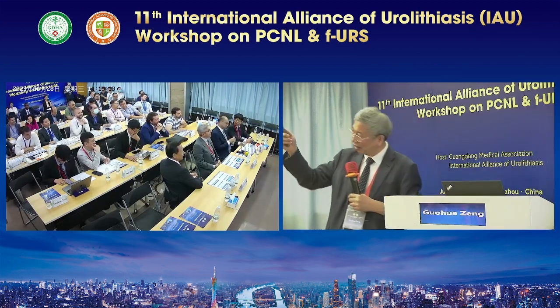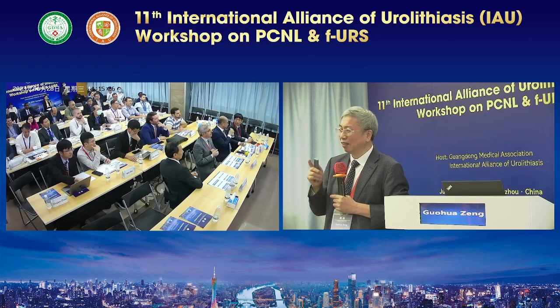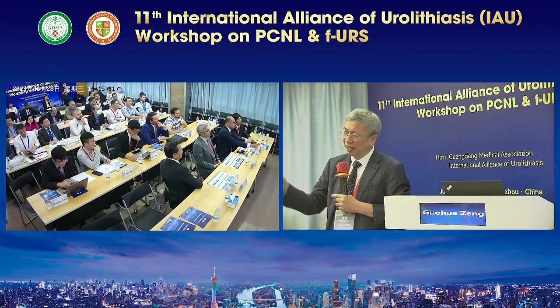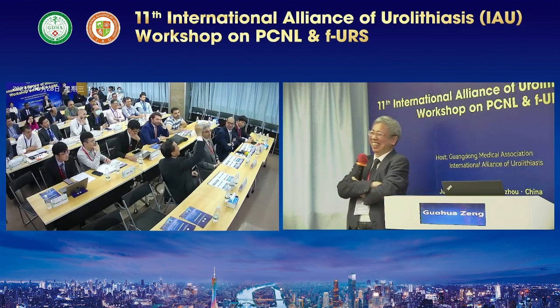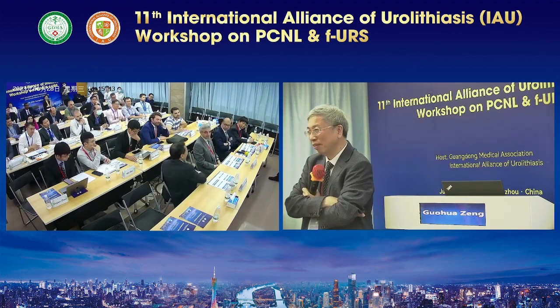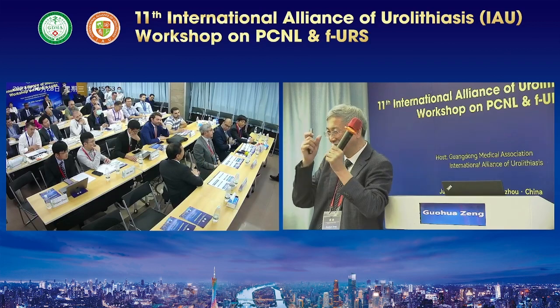Actually, come back to the real world. Actually, one is enough. Some very complex case, very difficult case, I use 2 guidewires. Some ureteral kinking, I use 2. Agree? The ureteric access sheath and your scope go over the guidewire. So I put the guidewire out, but when I put the access sheath out, the scope into the kidney, I take the guidewire out. I then have no guidewire. Totally agree.